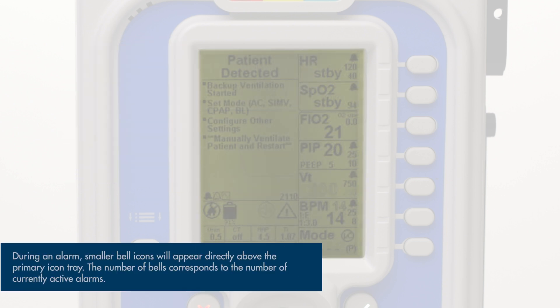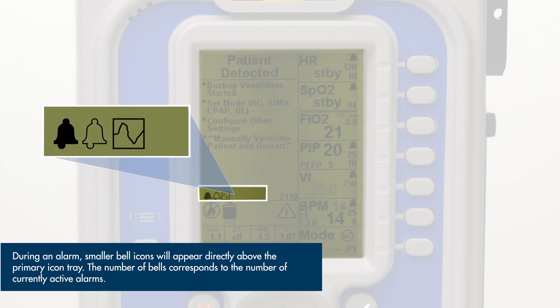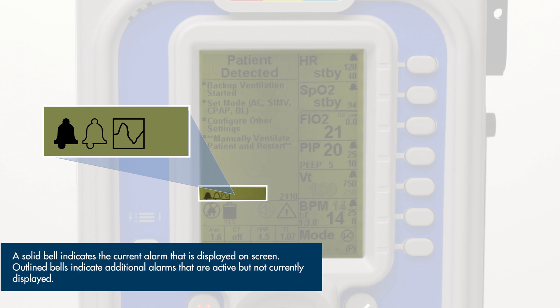During an alarm, smaller bell icons will appear directly above the primary icon tray. The number of bells corresponds to the number of currently active alarms. A solid bell indicates the current alarm that is displayed on screen. Outlined bells indicate additional alarms that are active but not currently displayed.